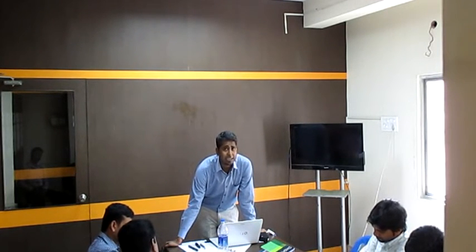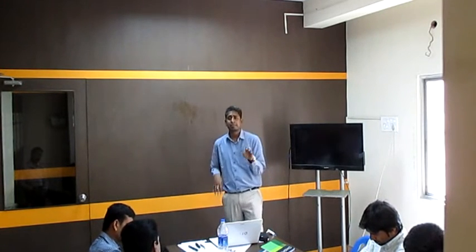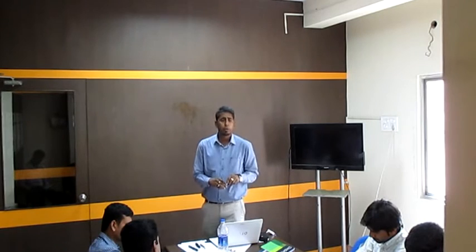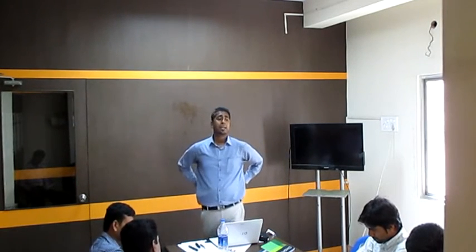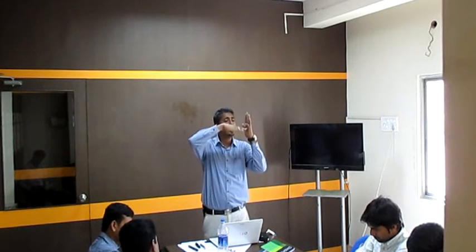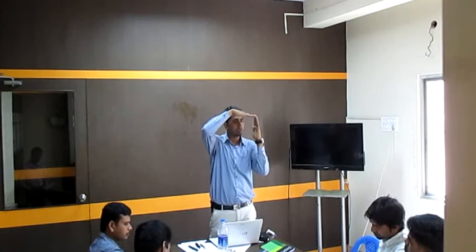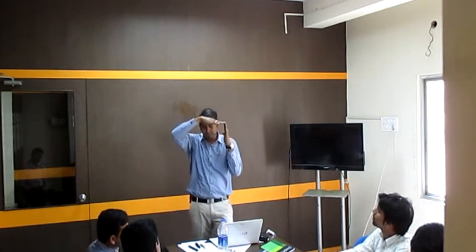Right angle handpieces are sometimes known as prophy angle handpieces also. Prophy, P-R-O-P-H-Y. Prophy angle handpieces, or it is known as right angle also. When there is an angle between your neck and head of 90 degrees, like this, straight 90 degrees, it is known as a right angle handpiece.